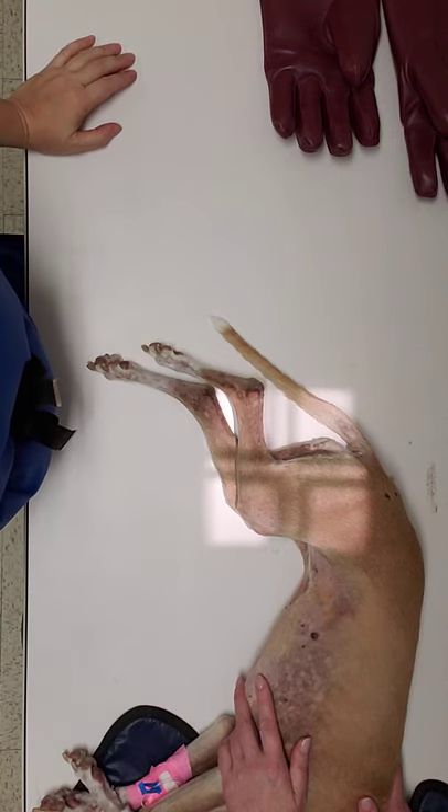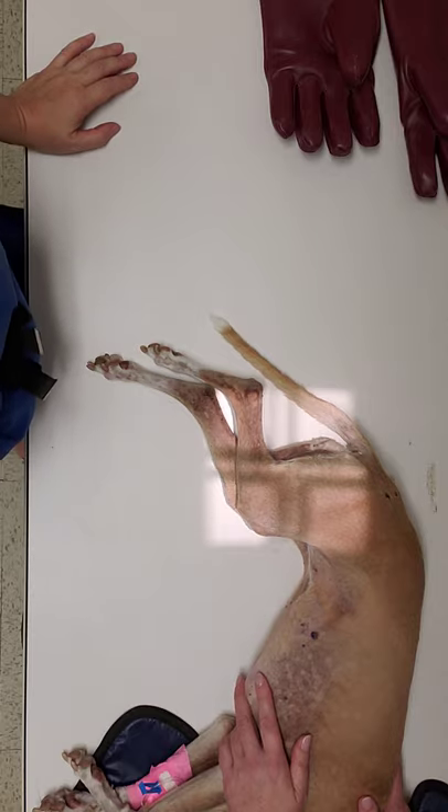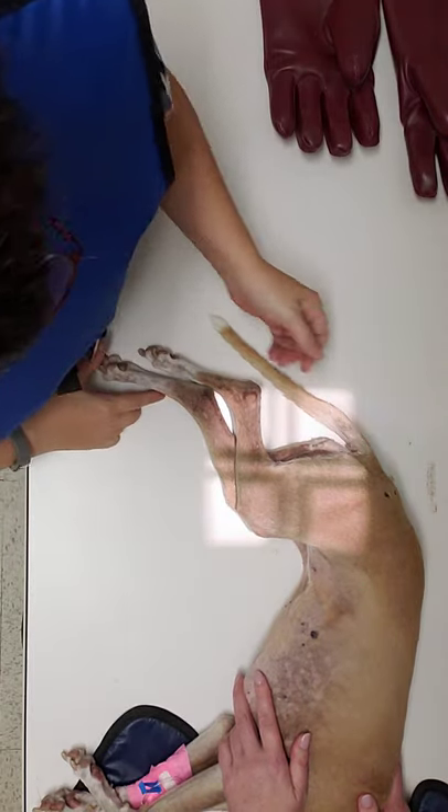Frequently as a technician you're going to be able to take an x-ray of a joint or a long bone. In this case we're going to focus on a lateral stifle of the right leg. So we put her in right lateral recumbency, her right side against the table.